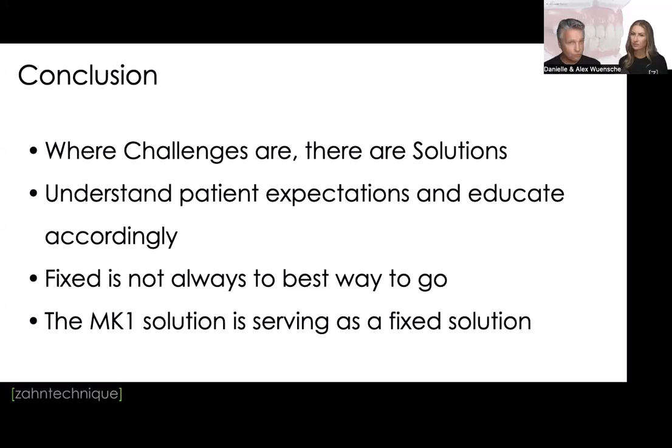The patient never removes it. They clean it with a water pick. The patient goes to the office every 3 months for their hygiene appointment. All the hygienist has to do with the tool is click, click, take it out, clean everything around the bar and inside the restoration, and send the patient home. And that's pretty cool as well. Keep in mind, it's always a design thing, right? So how we design it, we can use and wear it basically.